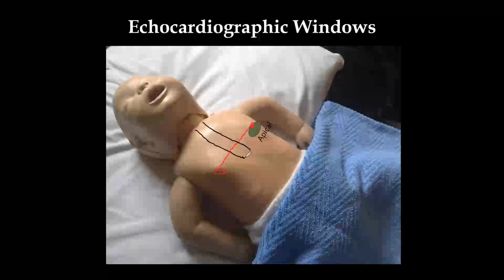This is your sternum. The views which have been taken from the nipple line and below, that is the lower one-third of the sternum, are known as the low parasternal views. So parasternal views are divided into two: low parasternal, nipple line and below, or the lower one-third of the sternum, and high parasternal views, that is above the nipple line or in the upper two-thirds of the sternum. So you have parasternal views.